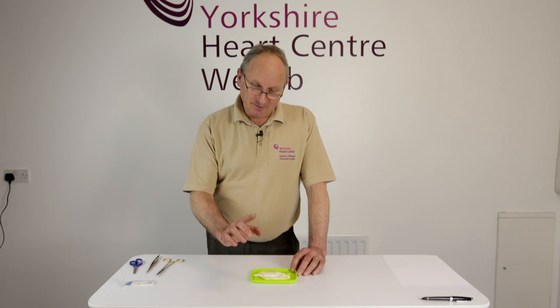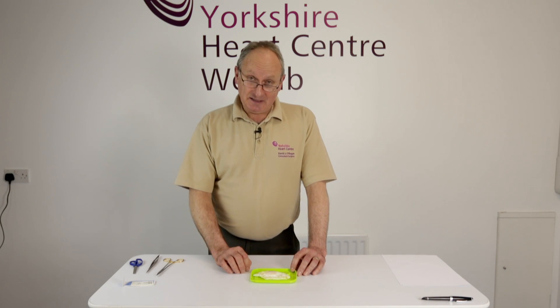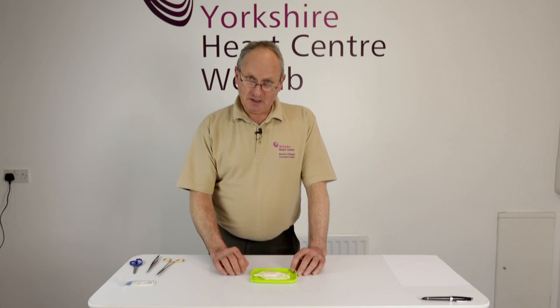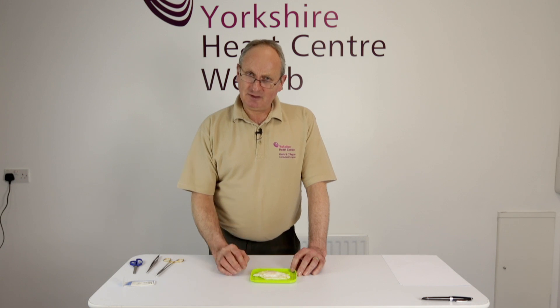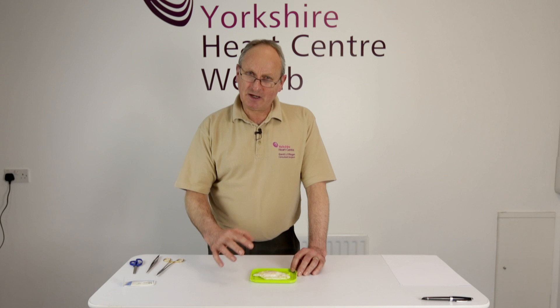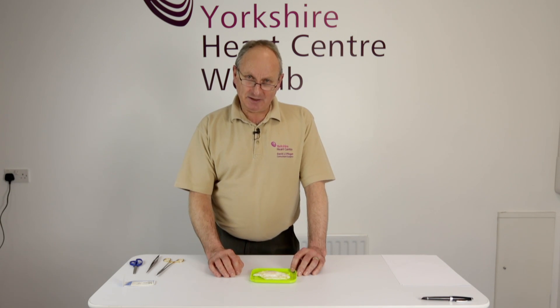You think I'm yoking, don't you? This is very difficult but it's going to teach you lightness of touch. It will teach you rotation. It will give you instant feedback if your rotation is actually clumsy. If you drag your needle in or drag your needle out, you'll find that you start scrambling the egg.